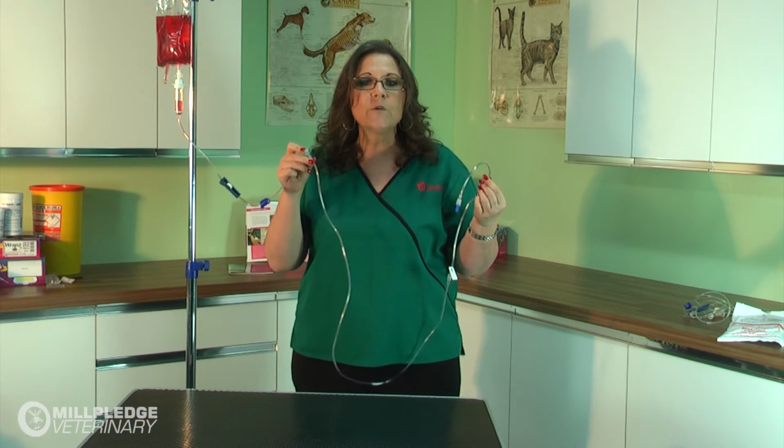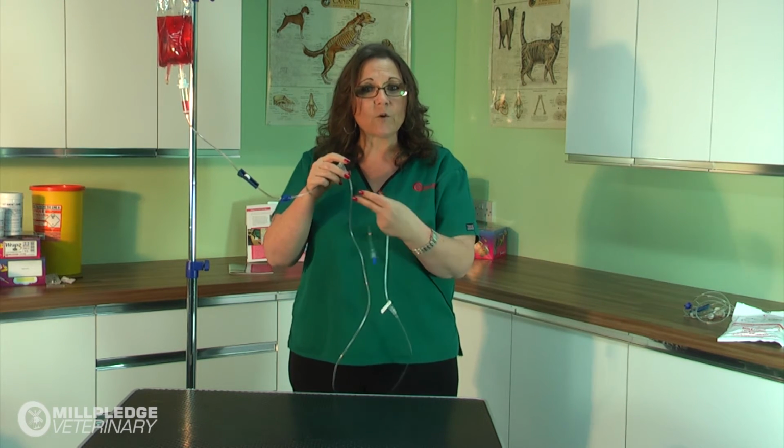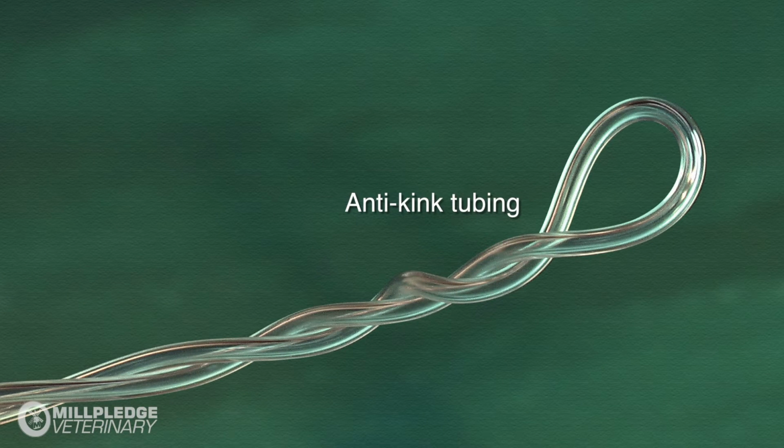All the tubing below the proximal injection site is actually anti-kink, which allows your patient to move around without causing any occlusion of the tubing.